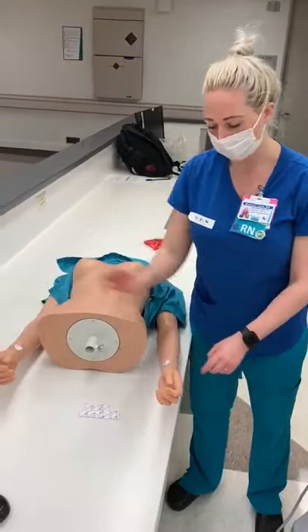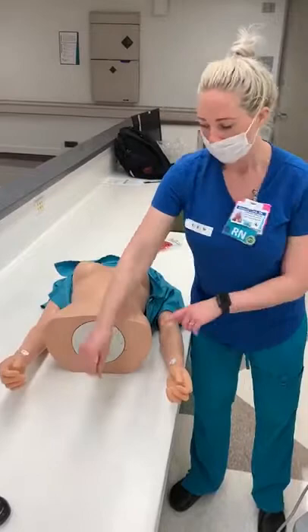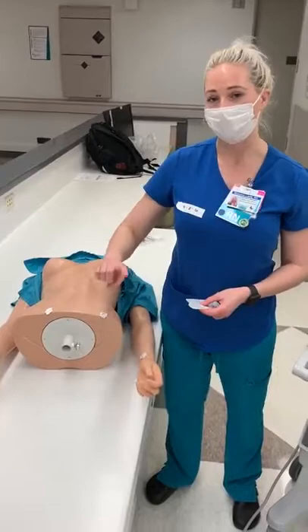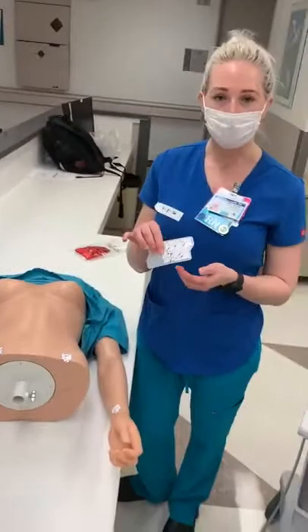They also need to go equal bilaterally. So if your patient has an IV dressing on their wrist and you need to move up the arm, then you need to put the opposite lead on the same spot on the other arm — you can't have one on the wrist and one on the forearm. This patient does not have any legs, so I would normally put it on the inside of the ankle, just above the ankle bone. I'm placing my tabs down facing towards the person's feet. That just helps so that the weight of the leads doesn't peel the sticker down and undo all the hard work you're doing.